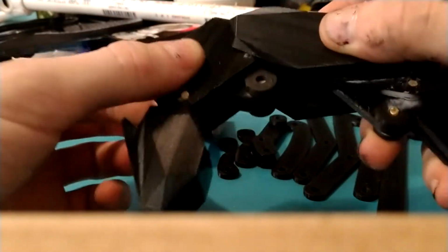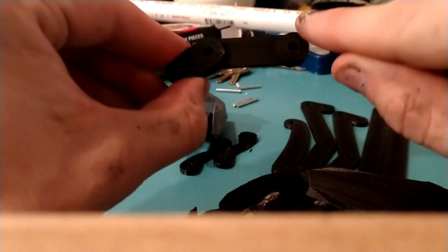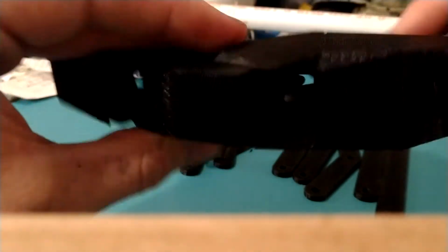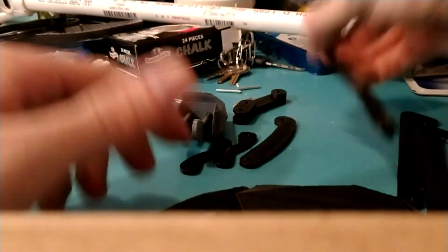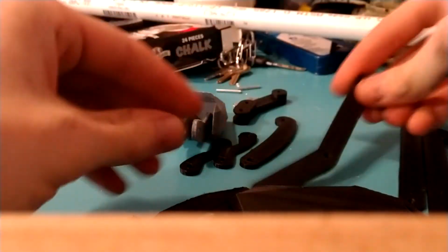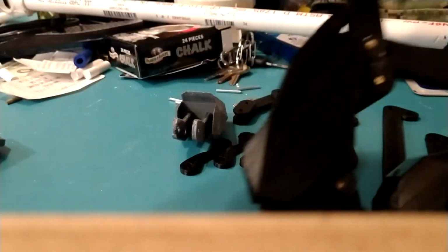So this mid finger plate, that actually fits on through holes, and is actually going to connect through the same holes through these holes in here. So it'll connect through those holes. But this back plate, I tried to attach it in a few different ways, but honestly, the best way that I've found is to just super glue it to these base bars. It's meant to fit real nicely on the base bars, but putting a pin in there, I find, just winds up making things more difficult, so I would just glue it on there. So, but yeah, that's how you do it.